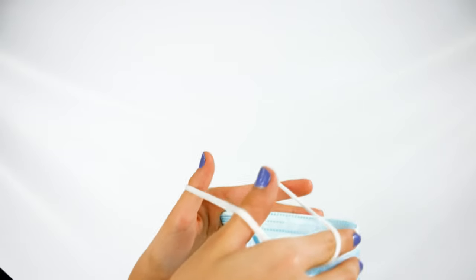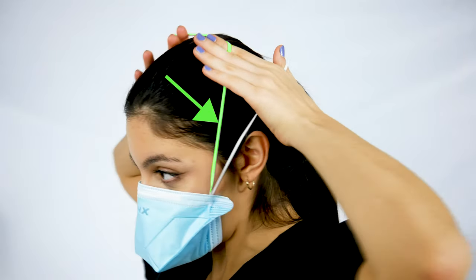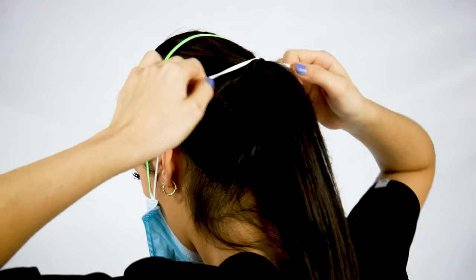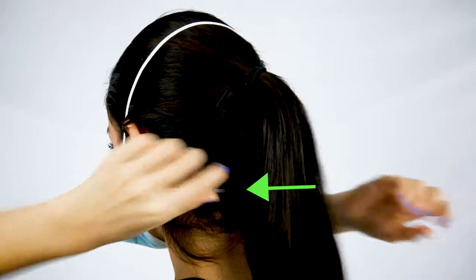Tilt the mask opening up and put the bottom part of the mask under your chin. Pull the bands over your head. Bring the longer band with your index fingers over your head and release it on the crown of your head. Bring the shorter band under your ears, placing it on your neck.